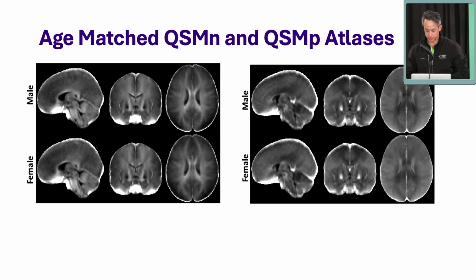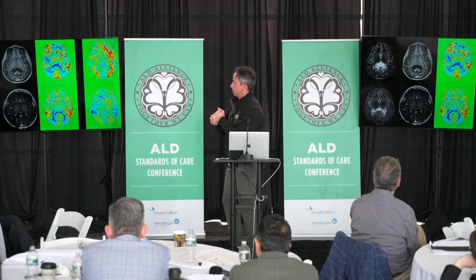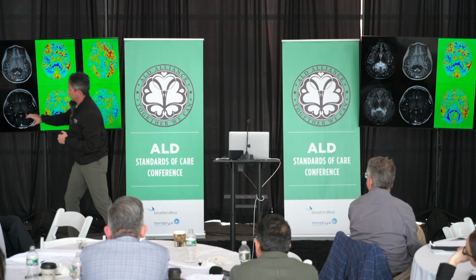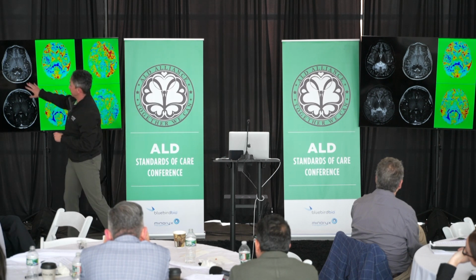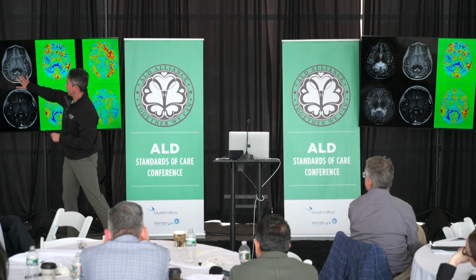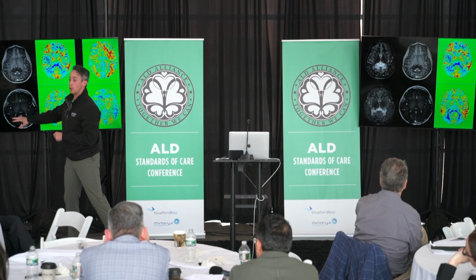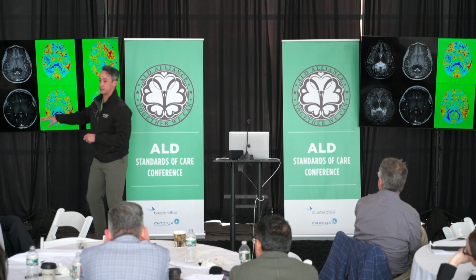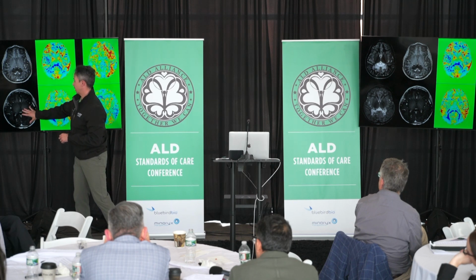Good. And so this is what we see. I'm going to orient you really quickly. The top row is one patient, one time point. This is a different patient, different time, all at one time point. This patient has lesional inflammation, right? So active demyelination. This patient has no active inflammation. This patient's MRI has remained stable like this for the past 3 years. So somebody with progressive disease, somebody with non-progressive disease.